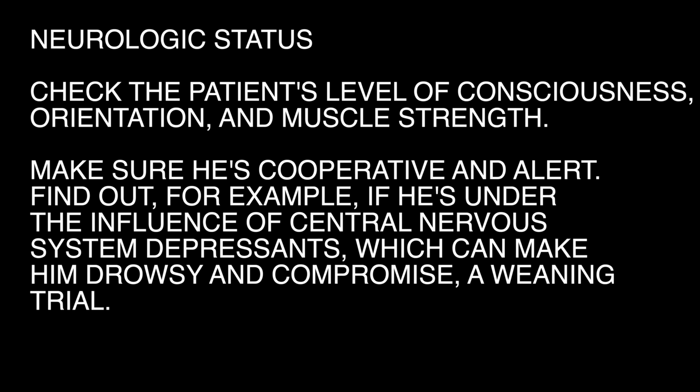Neurologic status. Check the patient's level of consciousness, orientation, and muscle strength. Make sure he's cooperative and alert. Find out, for example, if he's under the influence of central nervous system depressants, which can make him drowsy and compromise a weaning trial.